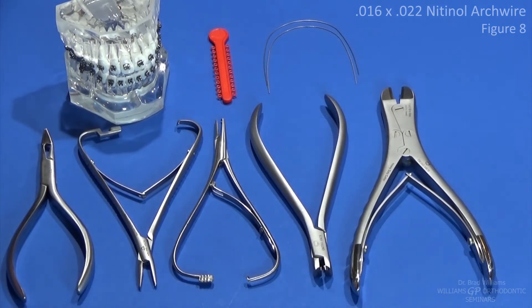To make this exercise — because it is really straightforward — we're just going to put the arch wire in, tie it in, clip the distal ends, and we're done. To make it a little more challenging, we want to go ahead and do at least one of these arches in figure eight ties.